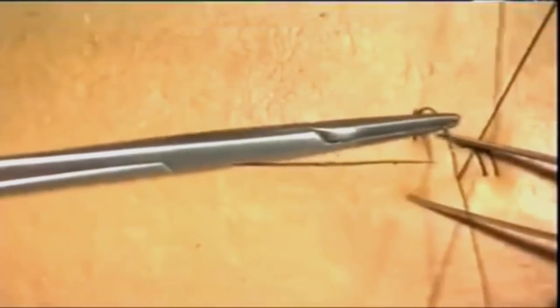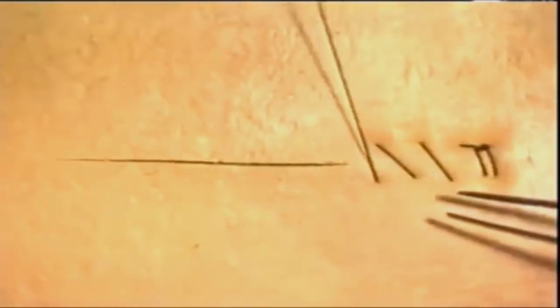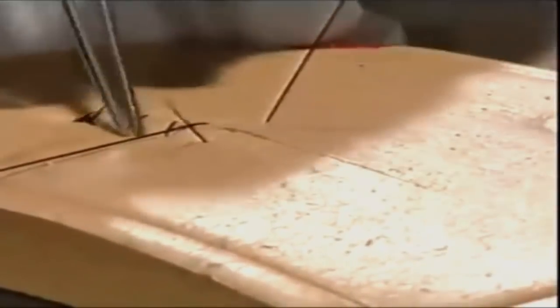Here comes the third suture, the distance apart being exactly the same as for interrupted sutures. Work along the wound each time ensuring the same tension, then hand it to your assistant who maintains that tension. Work along the wound ensuring equal distance between the sutures to ensure the same tension down the whole length of the incision.